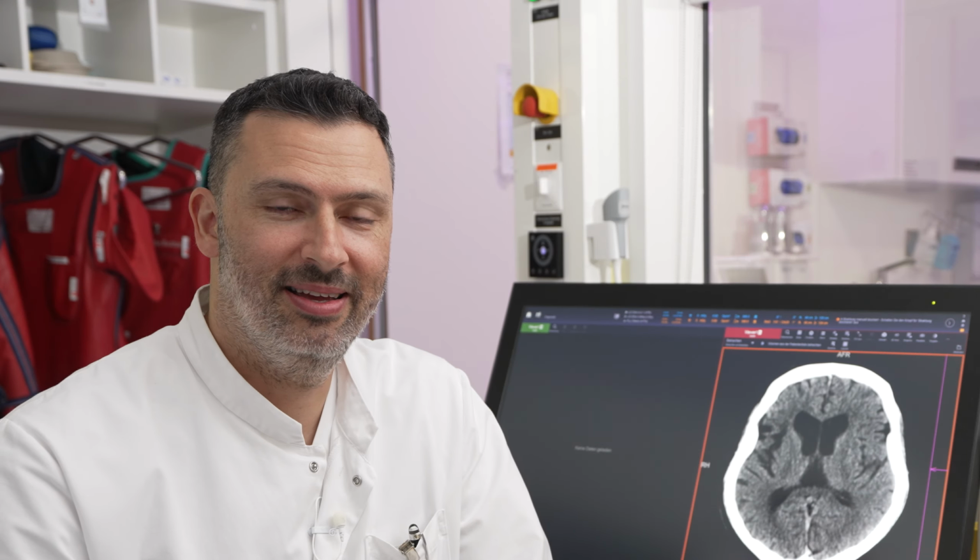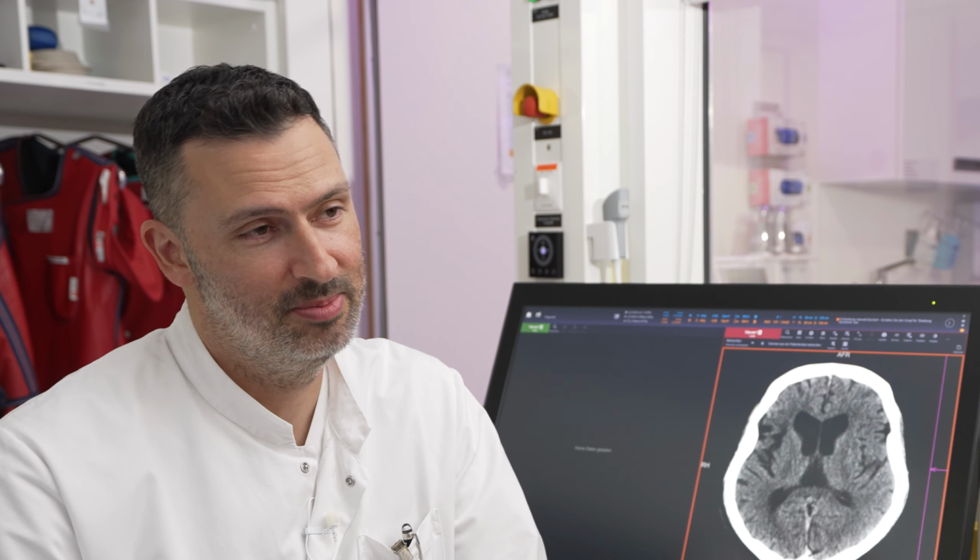So welcome everybody to another case of the week. It's been a couple of weeks, but we have a really interesting case today.